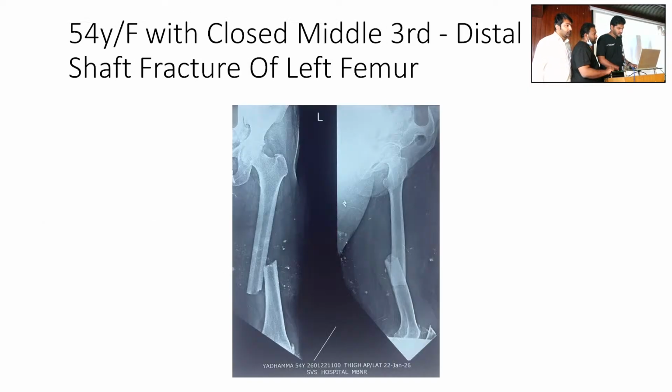It looks very, very narrow. Yes, sir. Age 54 years now. What is the nail size? 9, sir. Sir, we saw the canal was narrow.